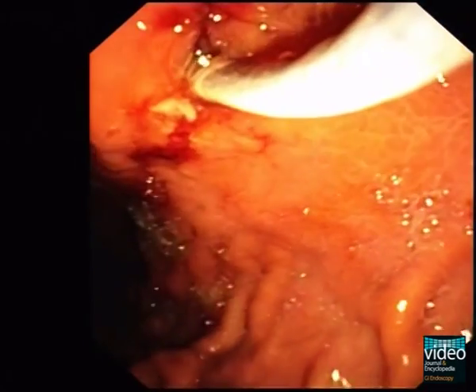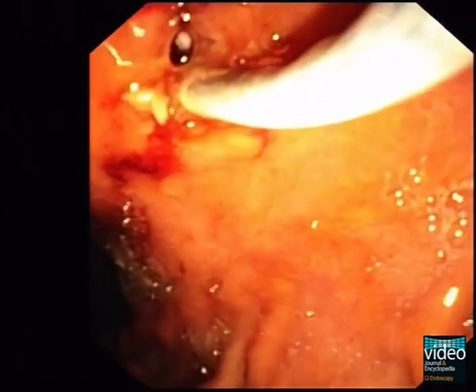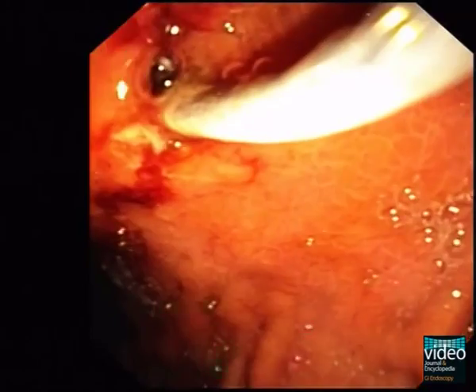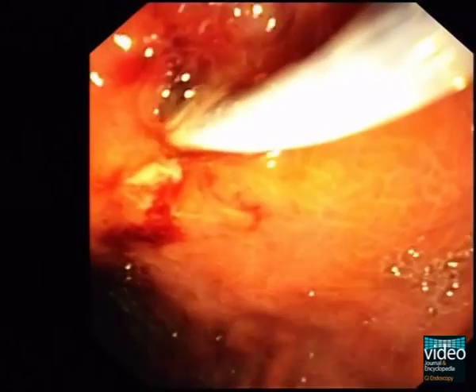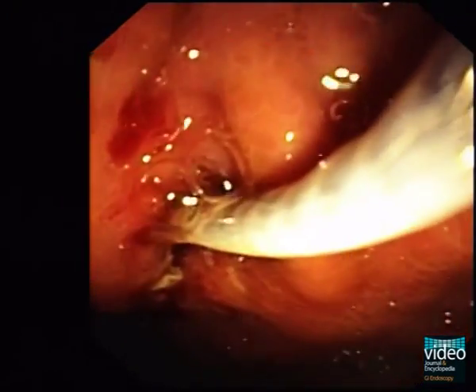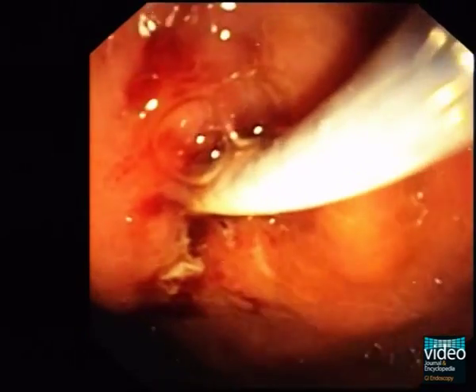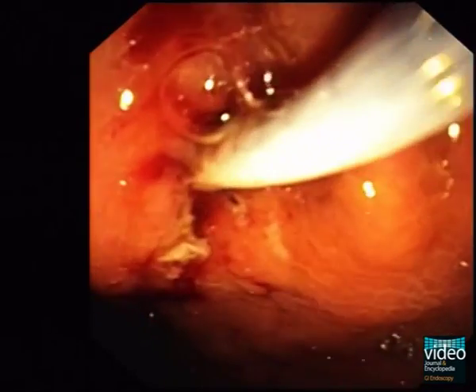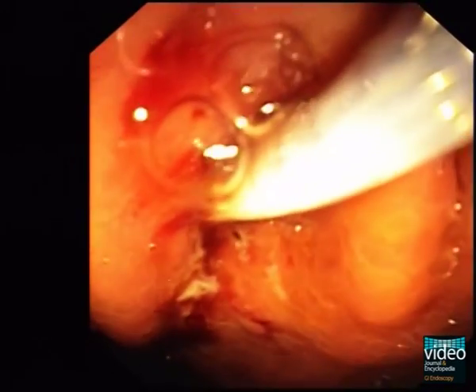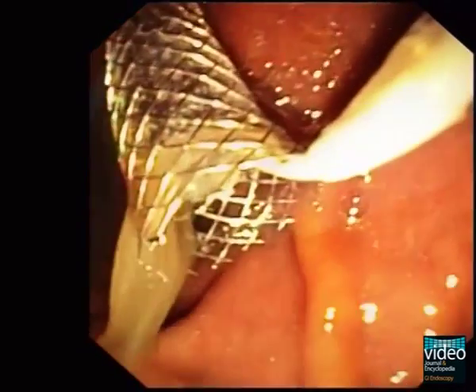The last part of stent delivery comprises gastroscopic control and checking the correct position of the stent using fluoroscopy. The favourable position of the intragastric or proximal end of the stent should be nearly 1.5 to 2 centimetres above the mucosa of the gastric wall within the gastric cavity.